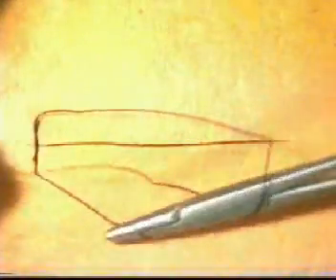We are now going to close the same incision using a continuous suture technique. Insert the first suture as before at right angles to the skin edge and ligate this using a standard reef knot.